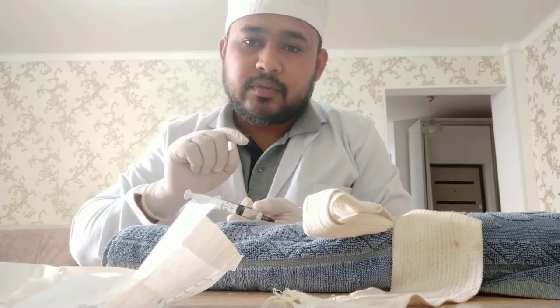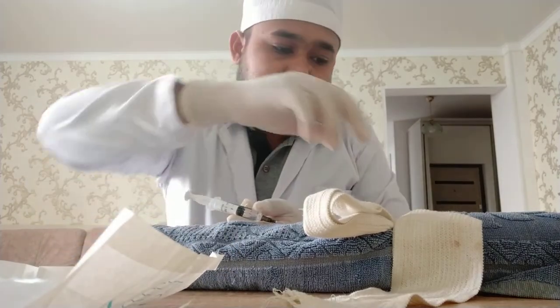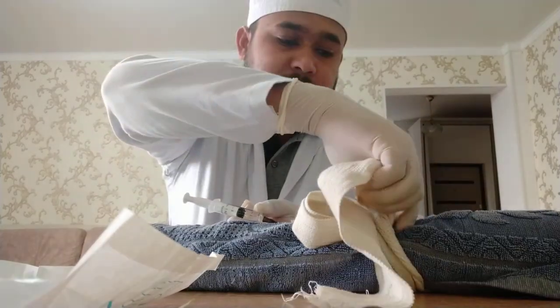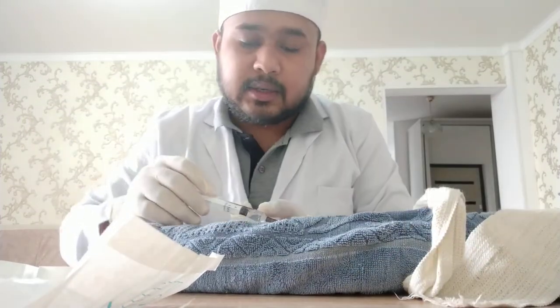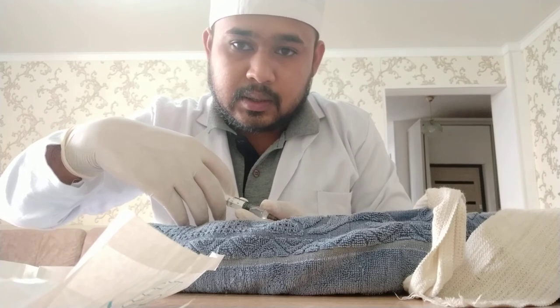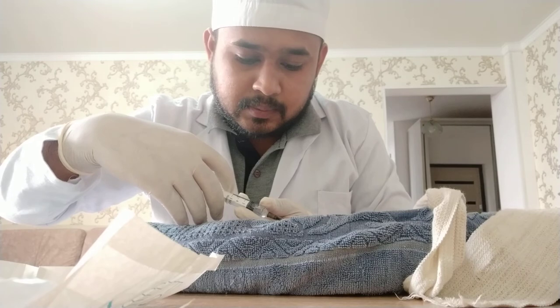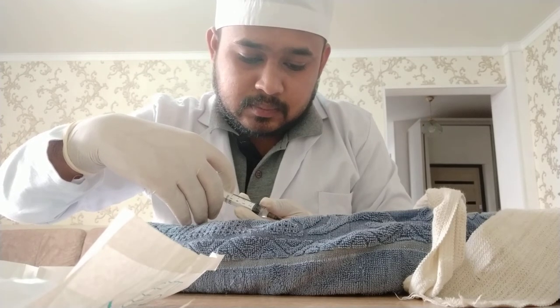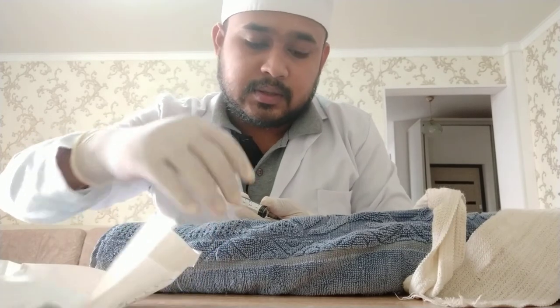Don't leave the syringe directly — hold it with one hand and free the tourniquet with the right hand so that the blood can circulate. And now I am giving it slowly, very slowly, not too fast. It's done.